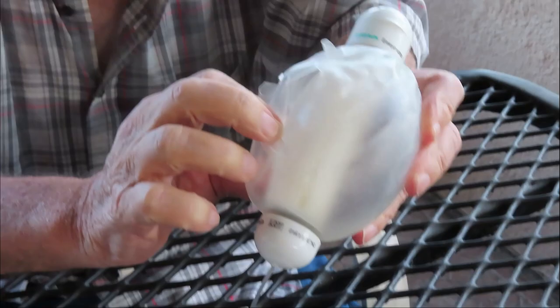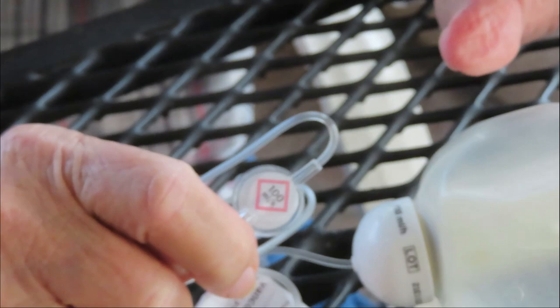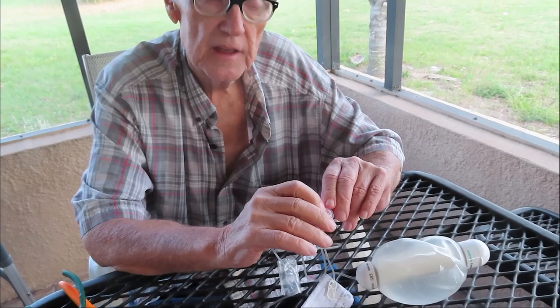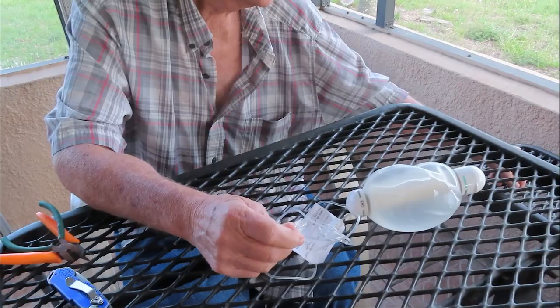Next, the output's here, which everybody knows. It goes through here. This is a flow control, is what I assume. All of these are my guesstimations, considering I don't know for sure 100%. This is a flow gauge here to let so much liquid come out here. Also, it catches air just in case it has some air that does come out. It's supposed to get caught in here and clog. This is the output that you unscrew. Now we're going to unscrew it. And they have this valve that you undo.